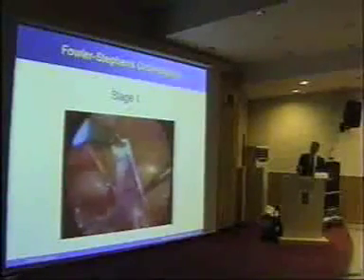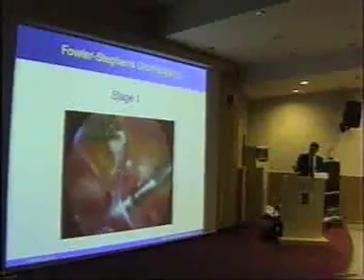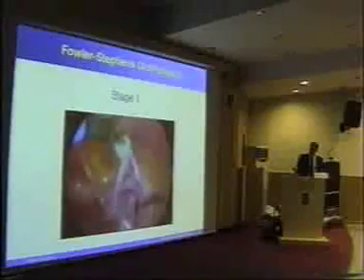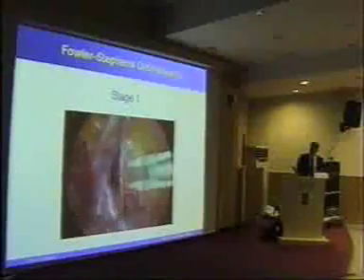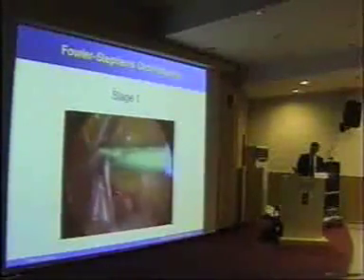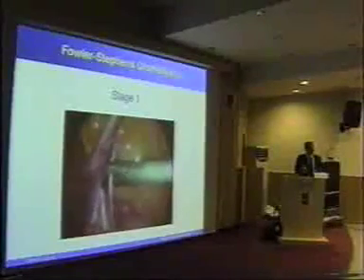Or you can do, in this intra-abdominal testis here, is the testis, is the vas here, and what we're doing is the vessels coming from above, again on the right side, we're making a little window, and we're just clipping the vessels at the stage 1. Here's an auto suture clip applicator, and we put a couple of clips on here just to identify the vessels for the later stage. And this is the principle of the two-stage Fowler-Stevens orchidopexy.